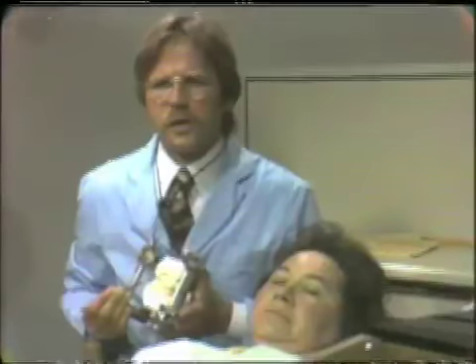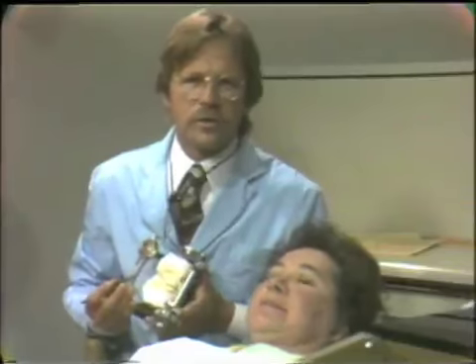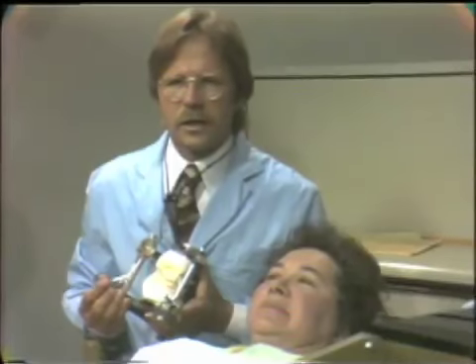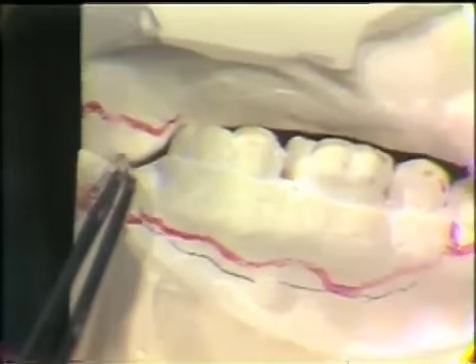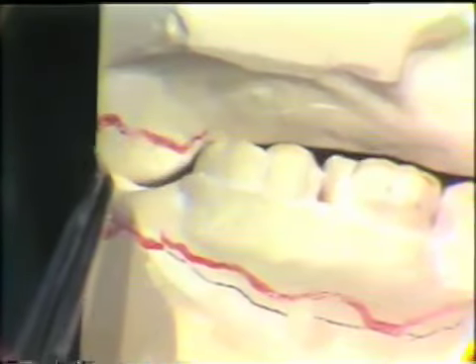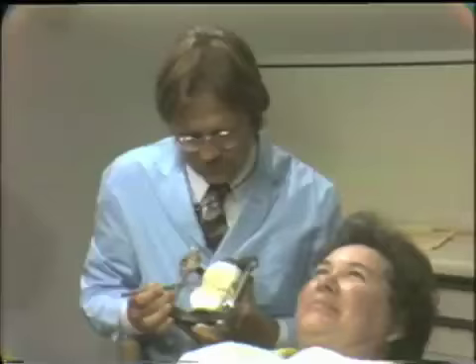We can also see on this cast, if we look just posterior to the teeth, the tuberosity area, and the tuberosity area on these casts is also impinging. Now, if you were to construct a complete denture, you could see that if you covered the tuberosity, such as the practice with a complete denture, that there is absolutely no room.